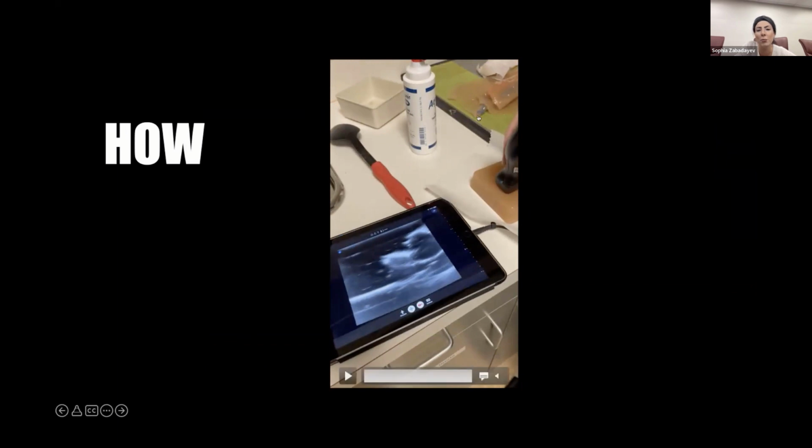So actually at the top right of that image, you can see what we had tried in regards to creating fascial planes, where we tried layering gel in different levels to try to simulate different lines in the gel to make it work, but it didn't translate very well on ultrasound.